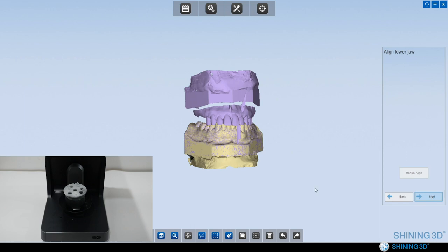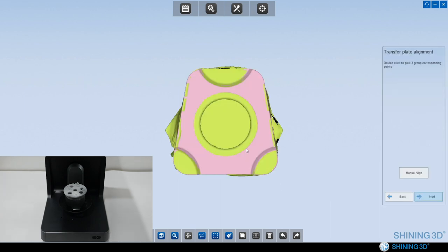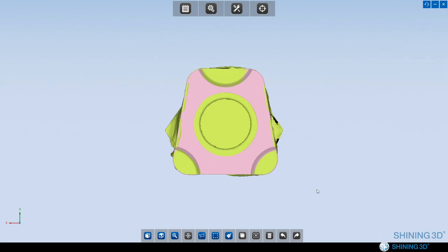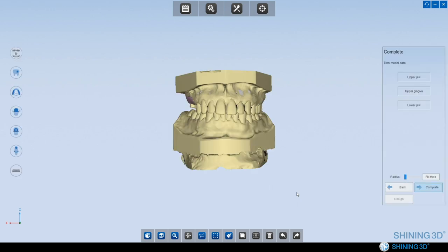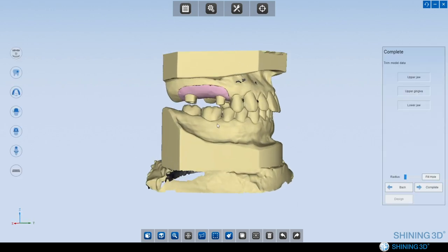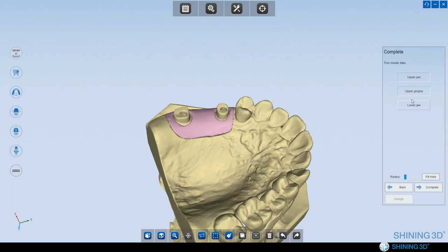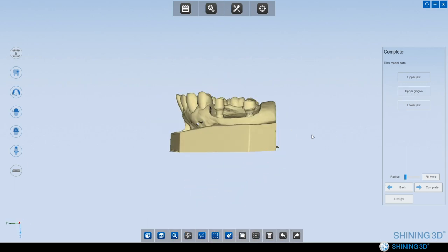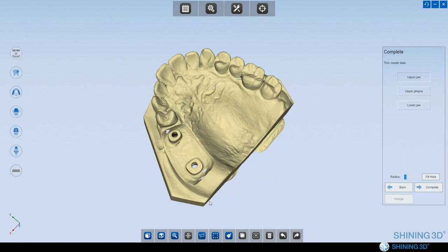Okay, and then no more work. Upper. So align the transfer plate. Then we get the whole case, lower, upper, abutment. Okay, let's check the margin of the abutment. Even if the margin is very sharp, with the DS-MIX, you see, it's very clear.